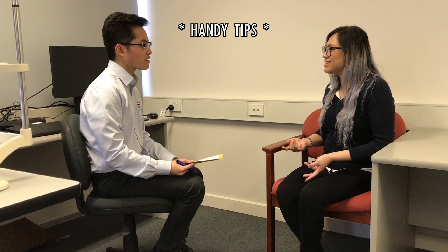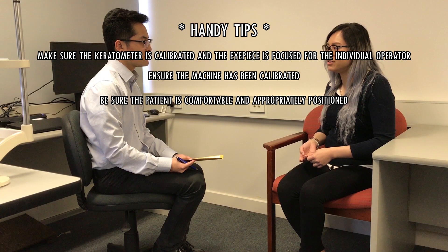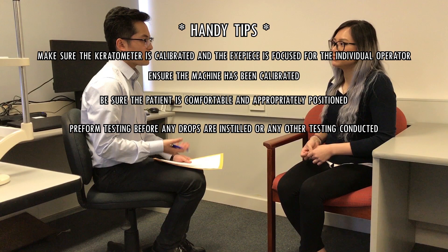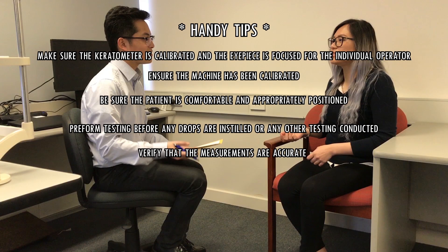Make sure that the keratometer is calibrated and the eyepiece is focused for the individual operator. Ensure the machine has been calibrated before use to ensure the accuracy of K readings. Be sure that the patient is comfortable and appropriately positioned. Perform testing before any drops are instilled or any other testing conducted. Verify that the measurements are accurate — you can do this by having another person double-check or by using a different type of equipment, such as an automated keratometer. Do not be afraid of repeat testing.